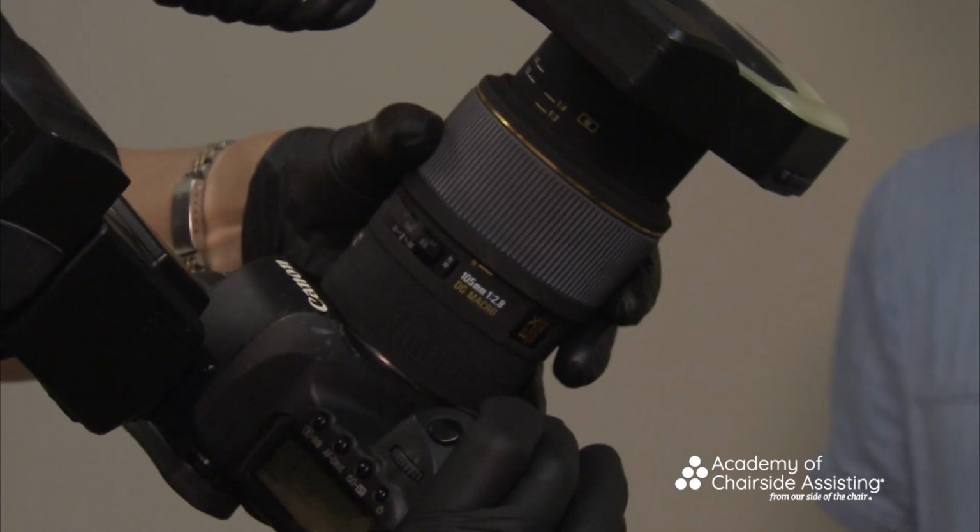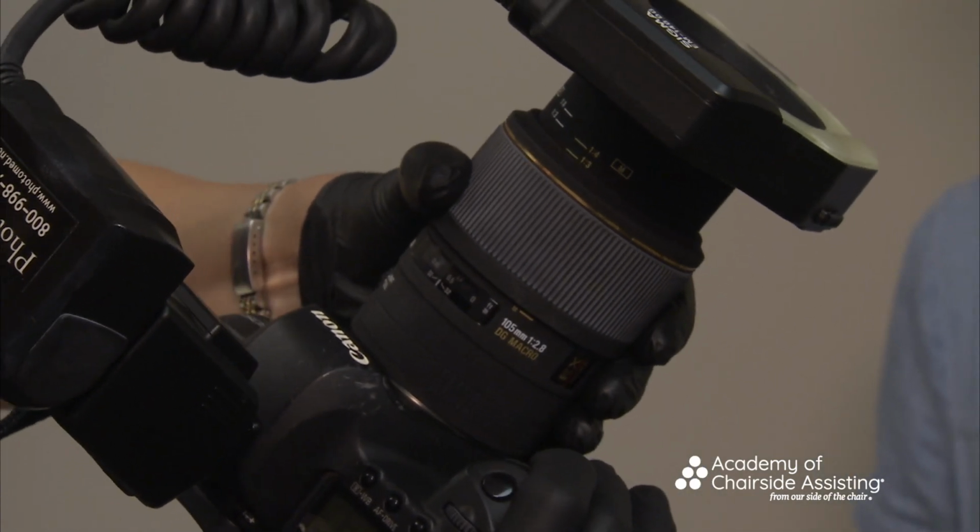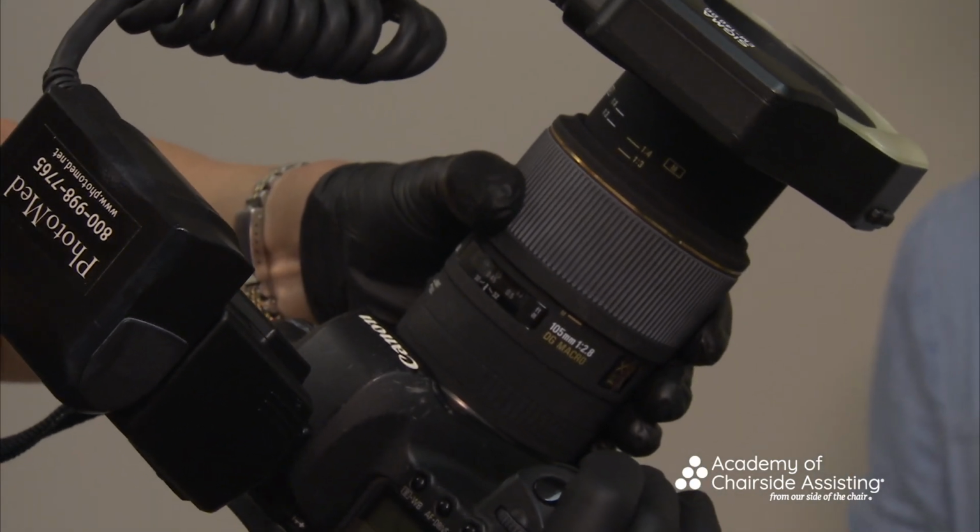But let's talk quickly, chin to lip. I want the same distance. Upper lip to nose. Notice that I'm dead in the center. I moved her head to make sure she's straight, but I want to come in just a little bit more. So for young adults, remember we were on the line for adults, I'll just ever so slightly come here. And this way you don't get as much tissue in the frame.